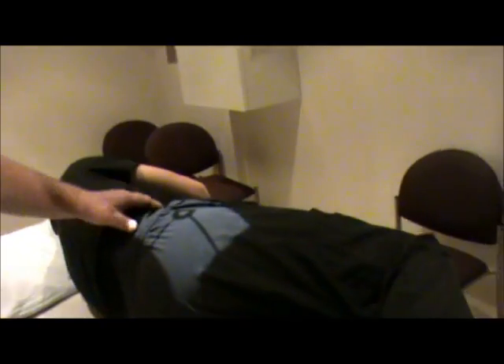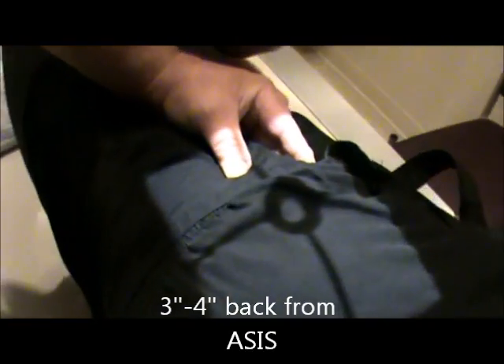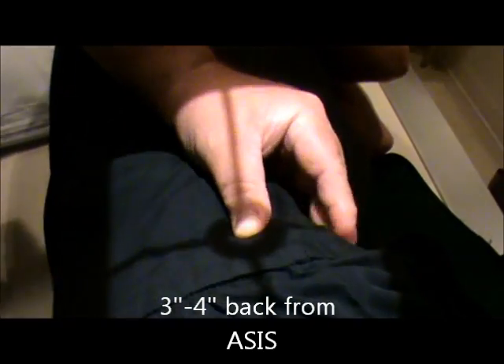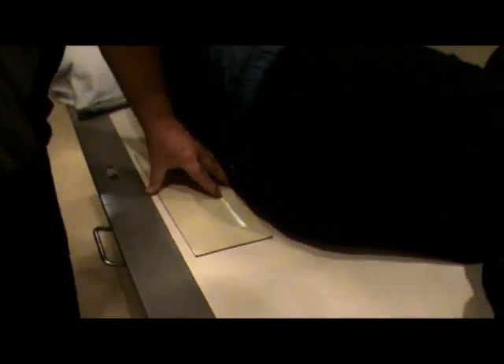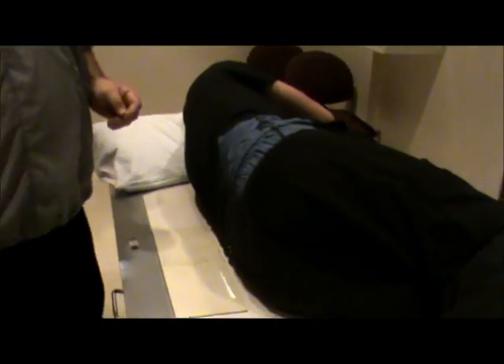For the lateral sacrum, with the patient in a good true lateral, we're going to palpate the ASIS and go about three to four inches posterior to the ASIS. That's going to be our centering. Place the marker toward the front in the corner of the light field. We can use a lead blocker, which helps absorb some of the scatter radiation and keeps the film from being too gray. Technical factors go up a little bit — technique will be somewhere around 81 to 85 kVp.